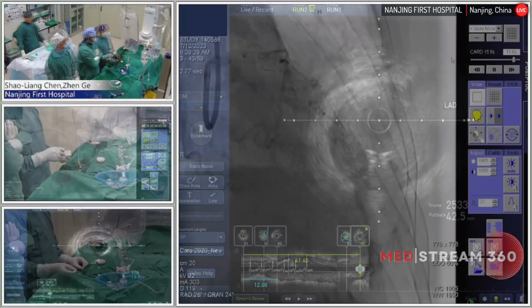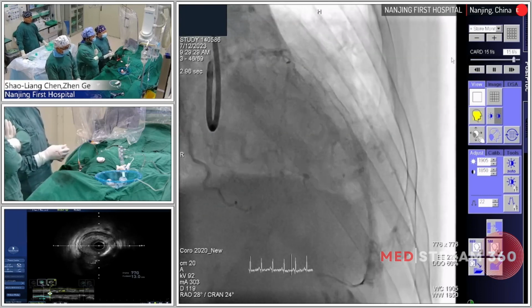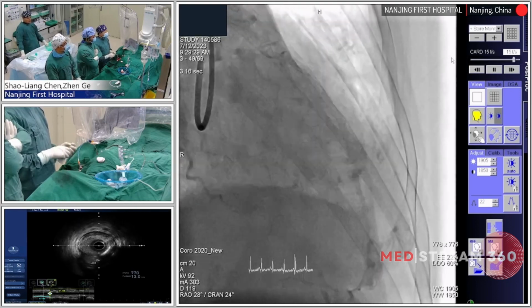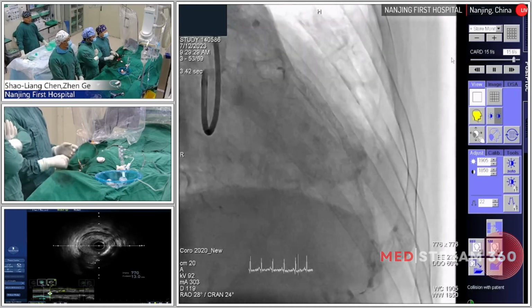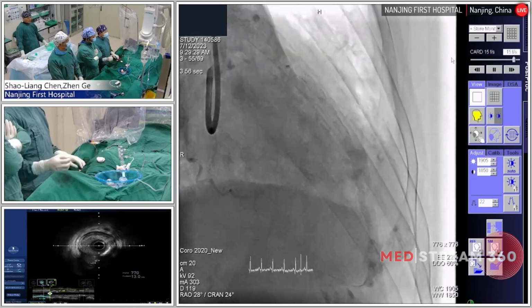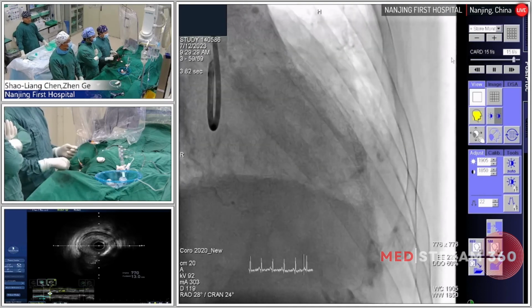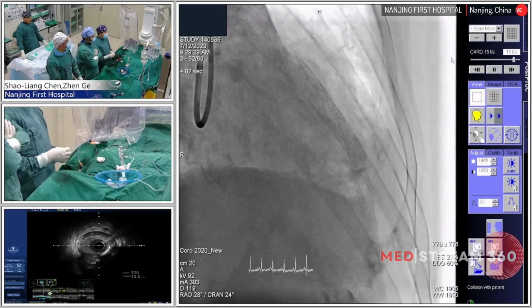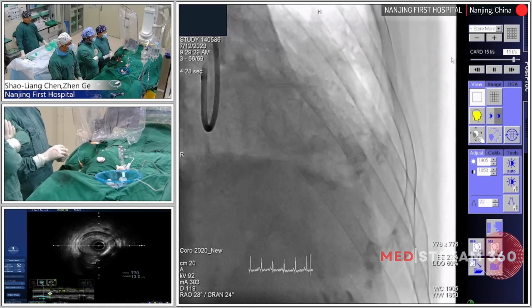Thank you. Today, we will treat this non-culprit vessel. In general, almost 25 to 30% of patients with acute myocardial infarction have multivessel disease. So complete revascularization for non-culprit vessels is a challenging issue. Two studies report the benefit of in-hospital staged PCI. It means the time interval between primary and staged PCI varies from 1 day to 7 days.